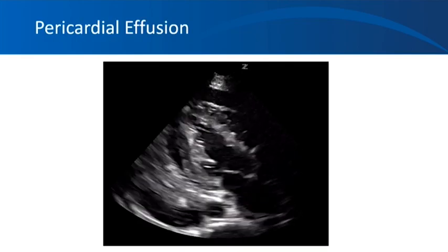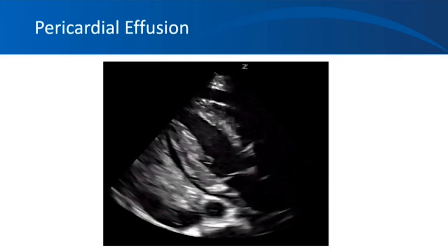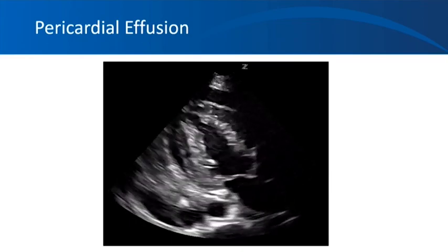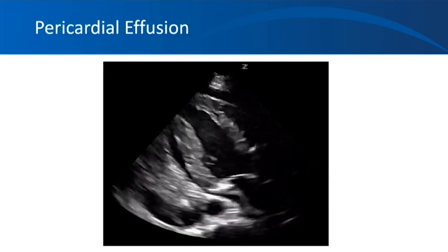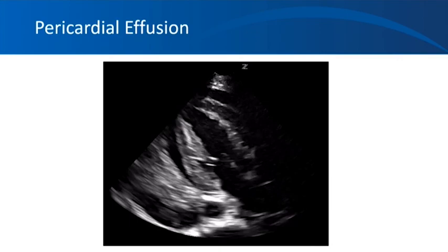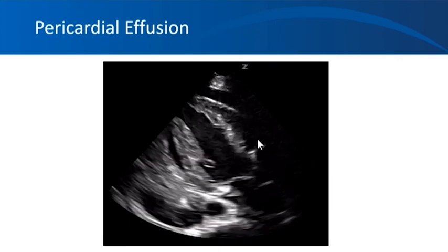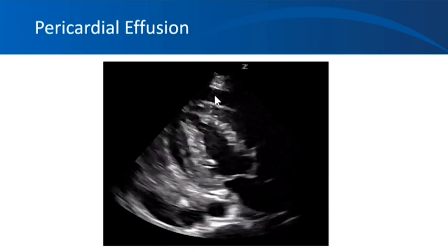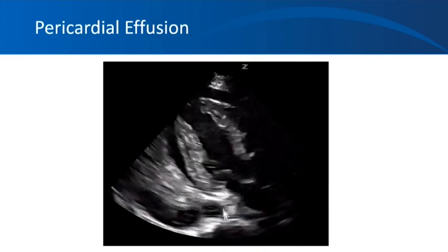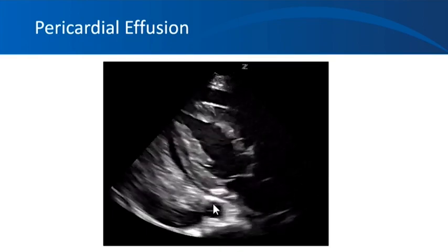And the next thing that you are looking for is pericardial effusion, especially in our uremic population. You might want to see what's the extent of pericardial effusion. You might also want to assess by the bedside, like you dialyze the patient for a week in a row or 2 weeks in a row, and then you want to see if the size has decreased or not. So essentially, in this parasternal long axis view, this black thing surrounding the heart represents pericardial fluid. And here, this part is descending aorta transverse section.